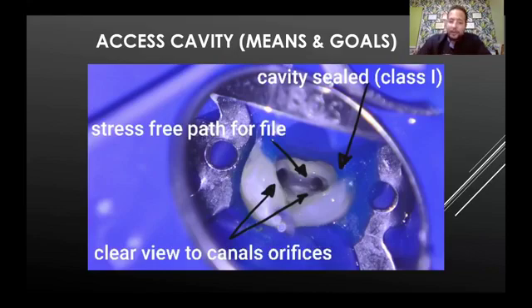So when I study my preoperative X-ray, I decide if I'm gonna go for a composite build up, to be sure that this tooth is restorable, or I will just build up with gingival barrier, and then I will restore the whole tooth in my final restoration after obturation. Because usually about 70% to 80% of my cases are single visits, so this tooth will be restored in a single visit. I build up the missing wall with gingival barrier. It's easier and takes less time.